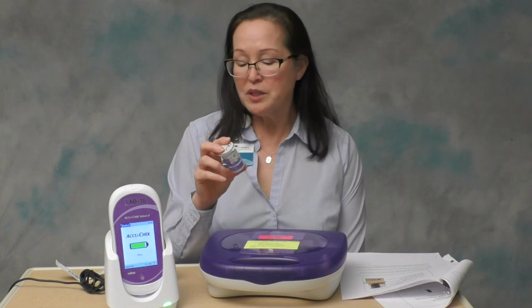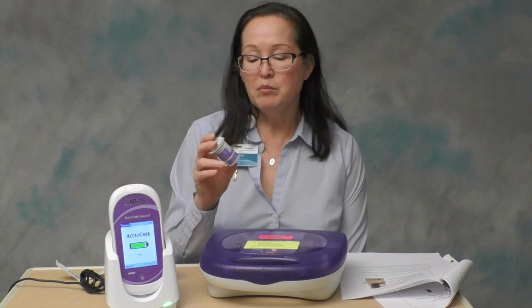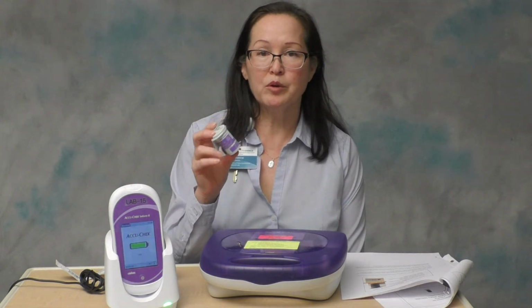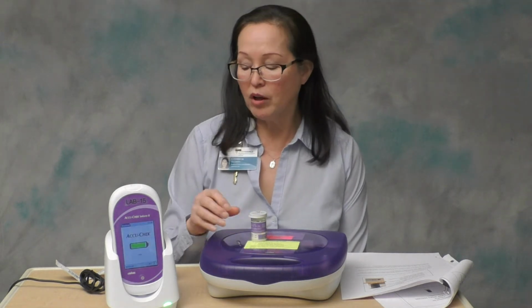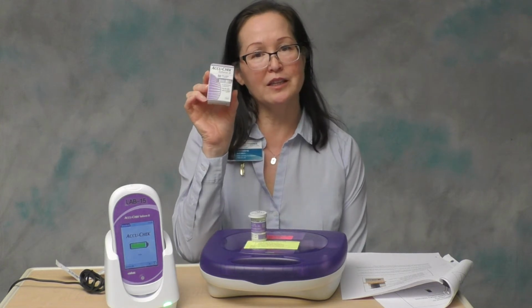These you can obtain from distribution. They are stocked in-house 24/7. In most of the units, they're either stored in the Pyxis rooms or the clean supply rooms. If you happen to run out, call distribution. They can tube them up to you. They come in a box that looks like this.